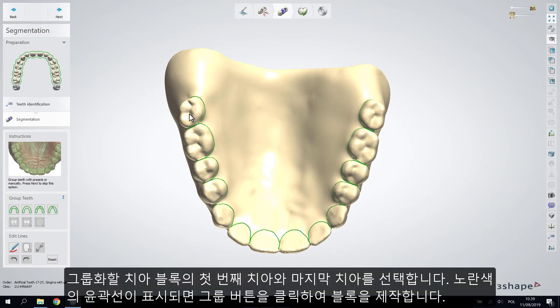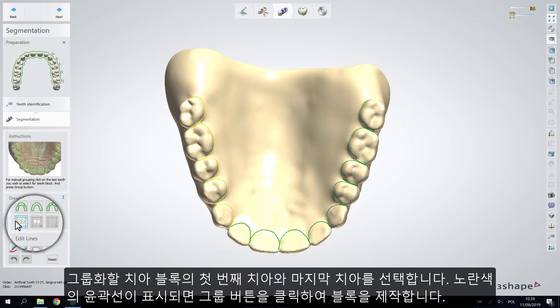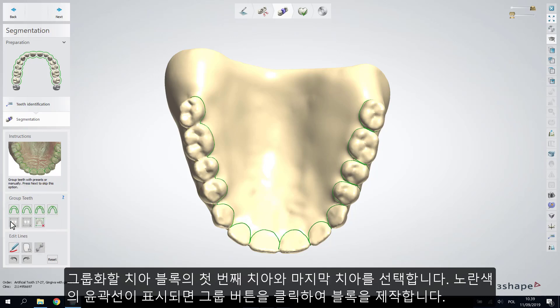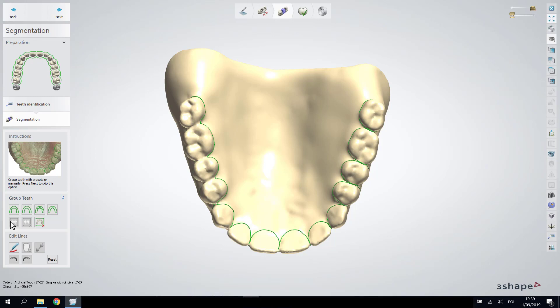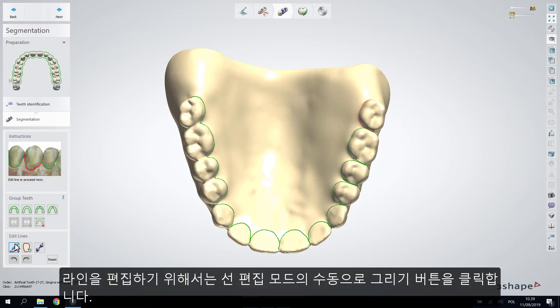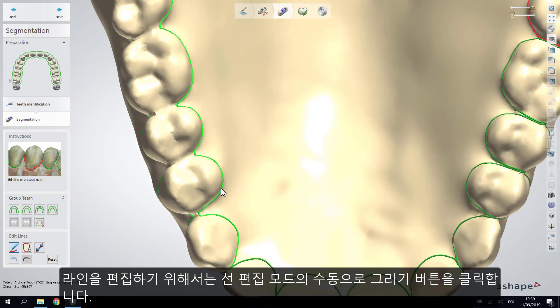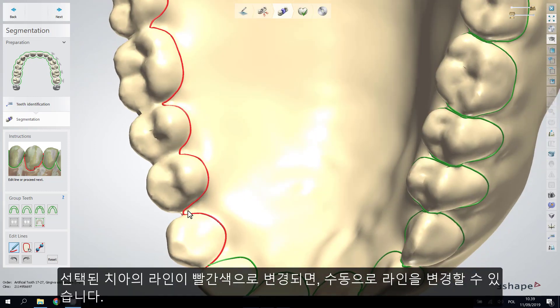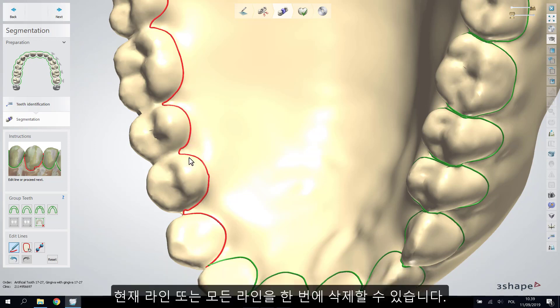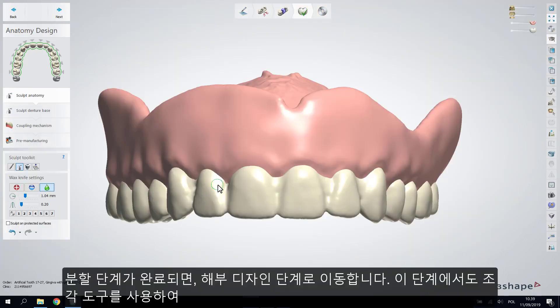You can also group teeth manually. To do so, choose the first and last tooth you wish to group — they will appear with a yellow outline — and press the Group button. To edit the lines, activate the manual line editing mode and click the 'Draw Manually' button; the line of the chosen tooth will turn red and can be modified manually. You can clear the current line or clear all lines at once.